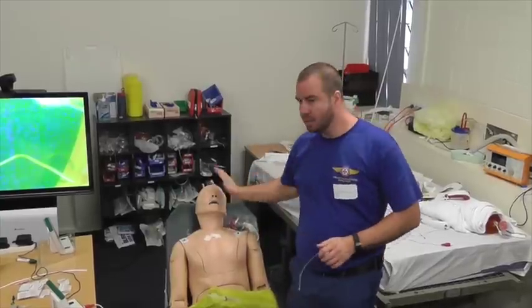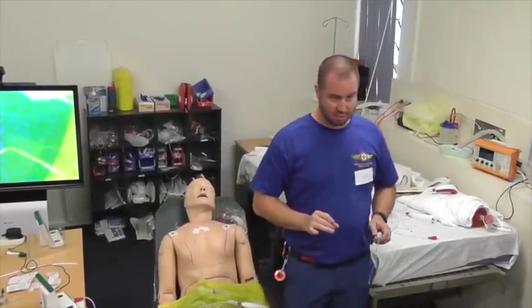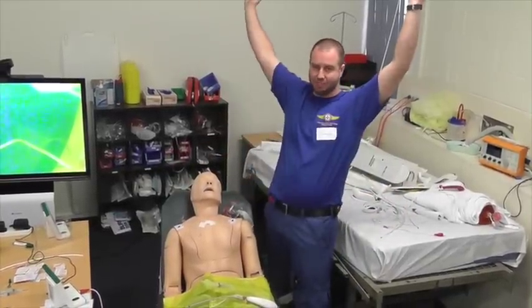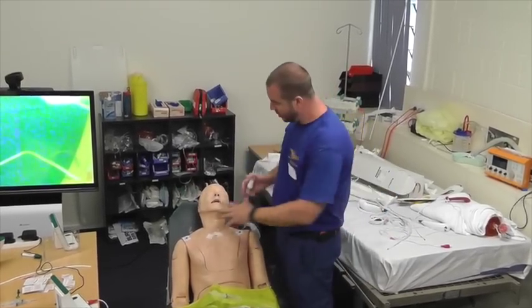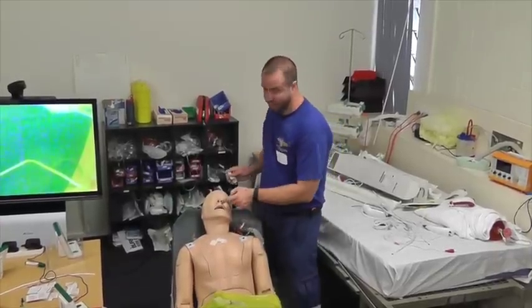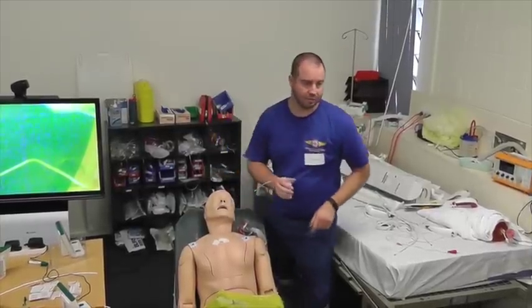It will go straight onto the vocal cords, almost universally. If they then develop a hoarse voice, jackpot, it's even better, okay? So I'm going to leave that while I'm setting up the rest of the kit. I'm going to have some pre-oxygenation on. I might cut off half of a Hudson mask or a non-rebreather mask. If I've got nasal prongs on, I'll put one up the nostril so that's ready, so the other nostril's patent for me to go through with my scope.